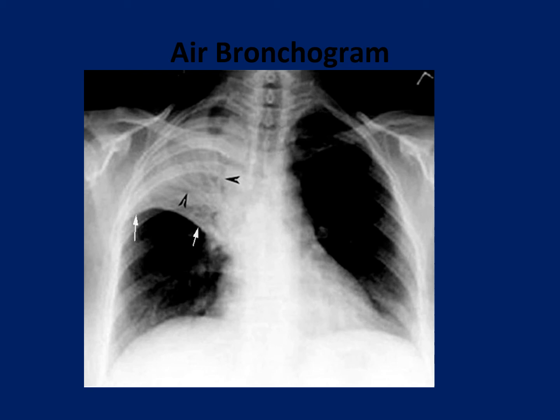So you're looking at the contrast, like with the pneumonia. The alveoli contain, and I think I might have misspoke, the bronchi are filled with air, okay, but the alveoli contain pus and exudate like in a pneumonia, but the bronchi are still patent. So you're seeing that contrast there with those black arrows, the black line being the air in the bronchi, and then the white part surrounding it is the thickening of the alveolar wall from the inflammation.